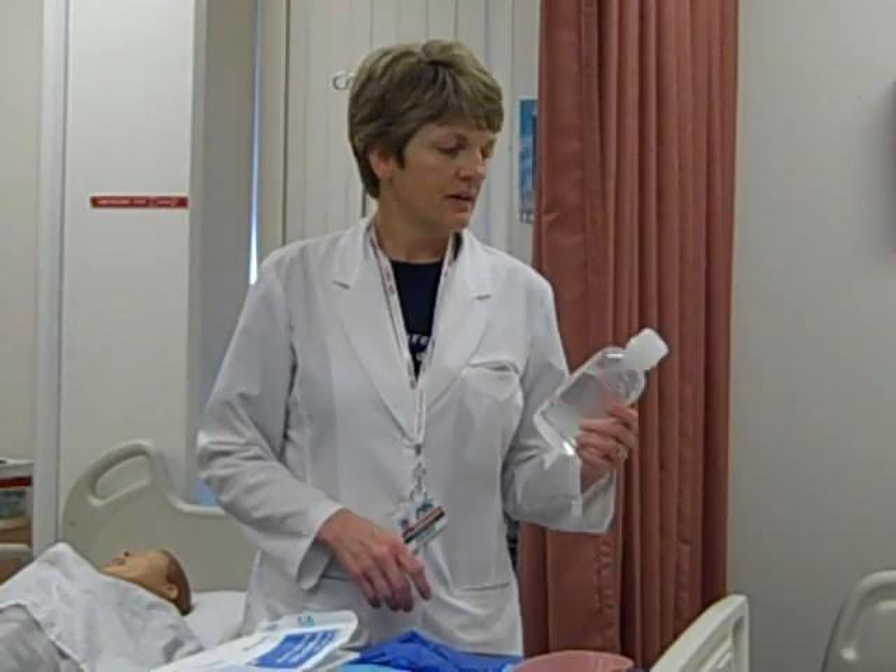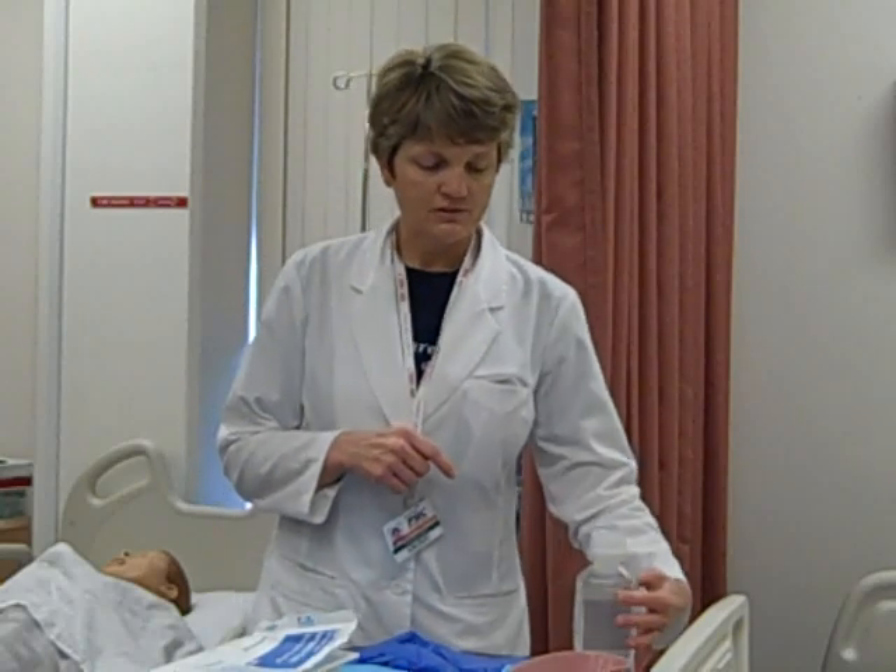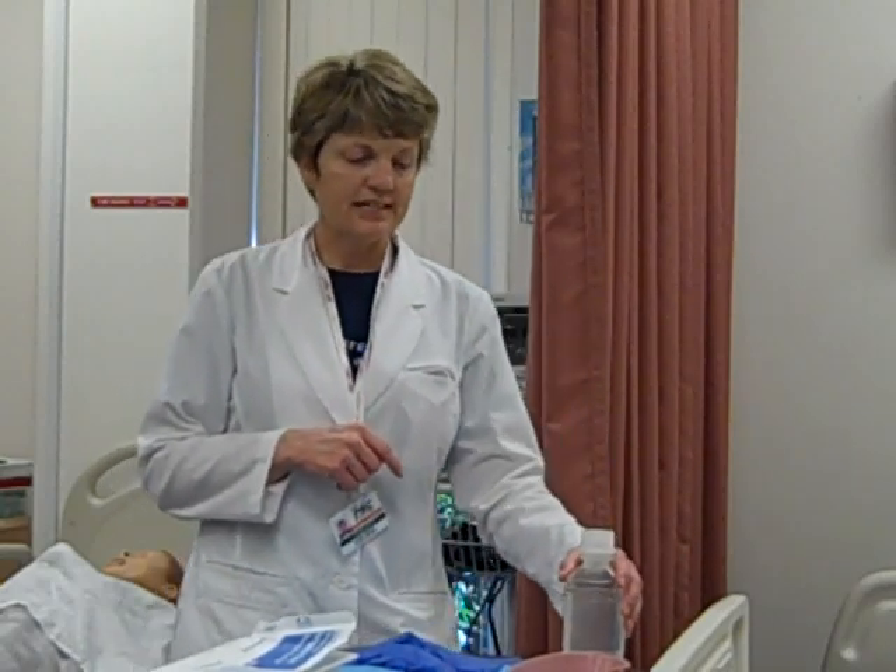I'm going to do eye irrigation. The materials you're going to need are an irrigating solution, usually normal saline. This happens to be a used bottle, so I want to make sure whoever opened it dated, timed, and initialed it. It's only good for 24 hours when you open solutions and leave them in the patient's room, so you always want to make sure you check the date.